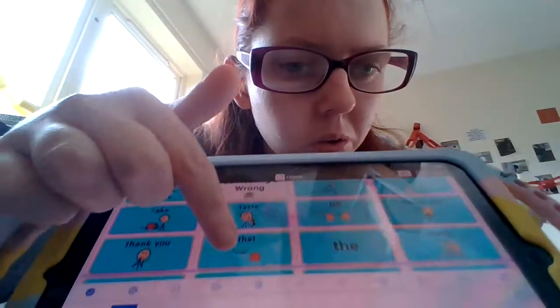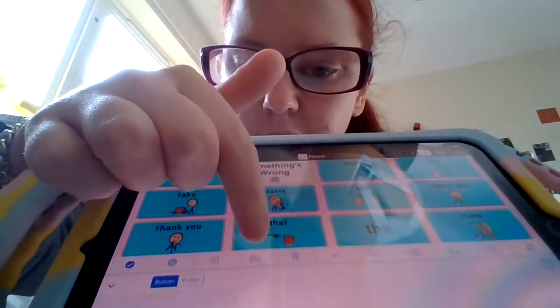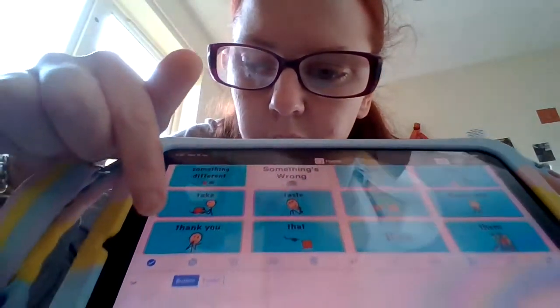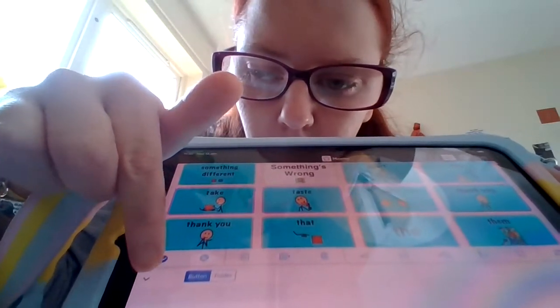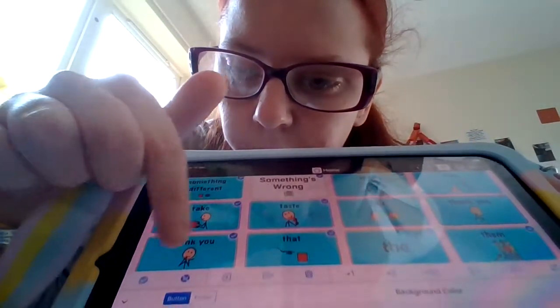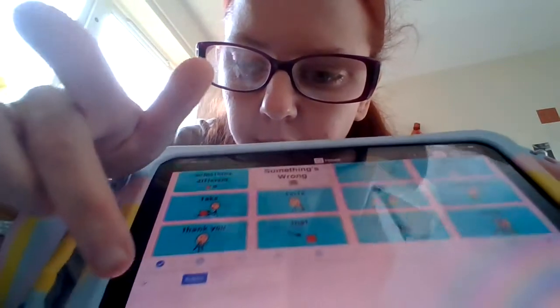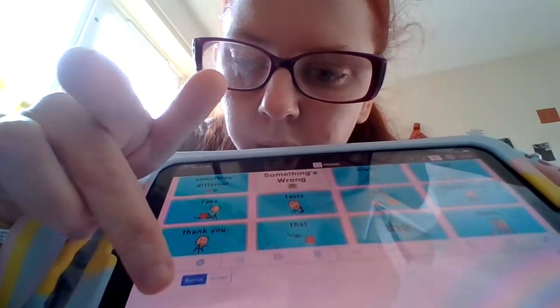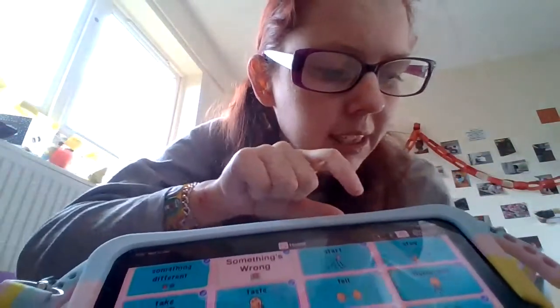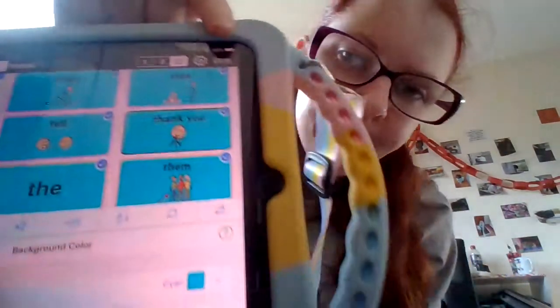Now there's also on this a rubbish bin, in case you want to delete something. There's also a paste and a copy button, and this one which is a tick that you press when you're done, which I am. Trying to do things upside down here, I apologise. There we go. Now I am completely done with editing, so I'm going to click on the big done in the corner.